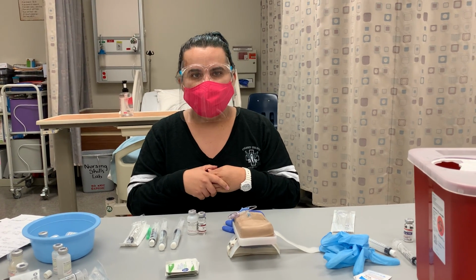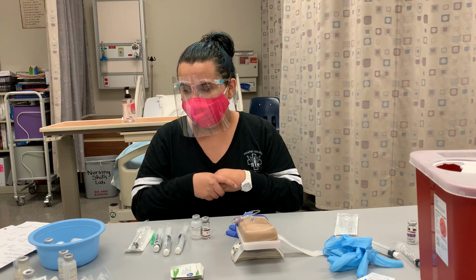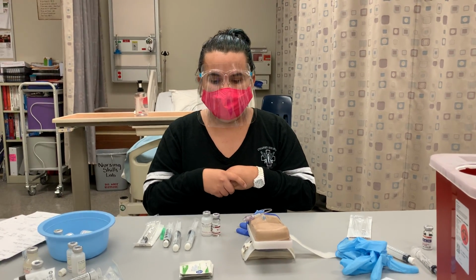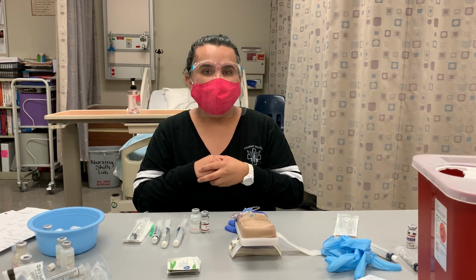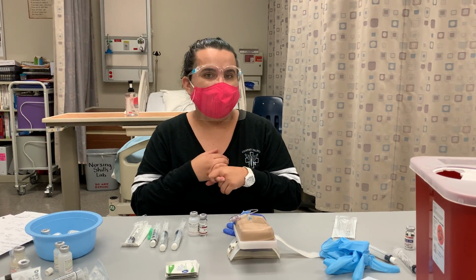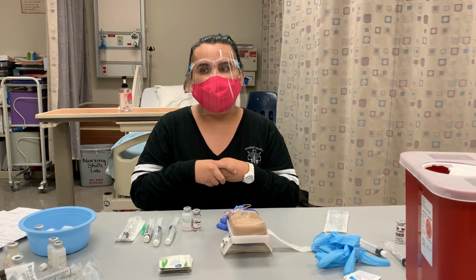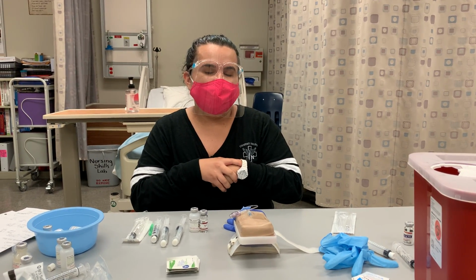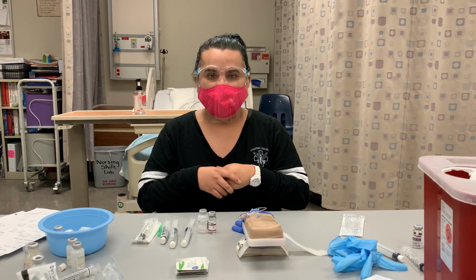For this example, I am going to be giving 4 milligrams IV push of morphine. My patient's in pain. I assessed his vital signs. I checked for respirations, BP, heart rate, and pain level. He rated an 8 out of 10 pain. So I'm going to go ahead and give him some morphine.